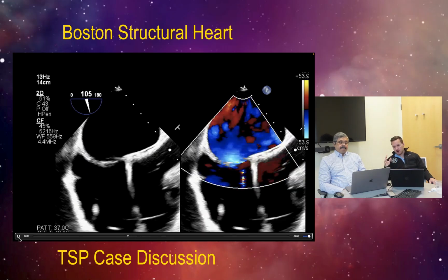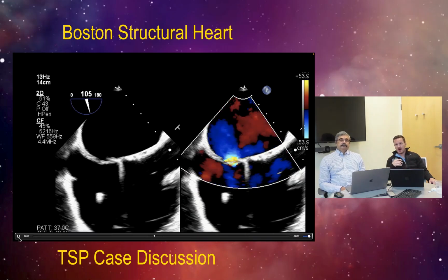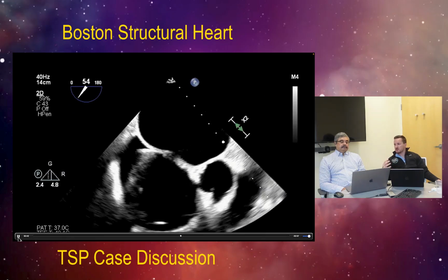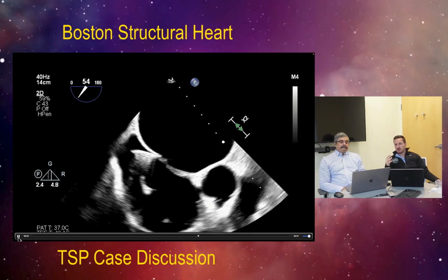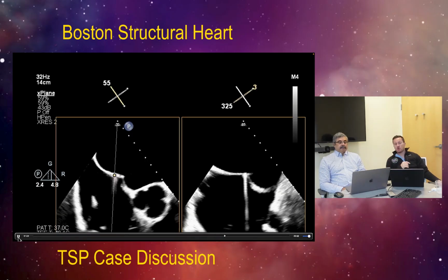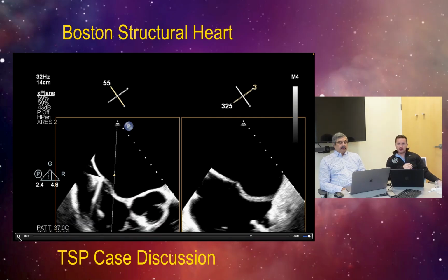And one thing I will say about the PITLOC protocol is that even prior to us beginning the septal puncture, another very important phase is the planning phase. And Feroz, I've done many procedures with you, and I know that we as a team with the interventionists and the echocardiographers will sit down before any needles are introduced to the patient. We will decide what is the plan for the mitral clip, but also more importantly, what is the plan for the septal puncture. Do we want to be very posterior? Do we want to be mid? Or do we want another location on the septum?